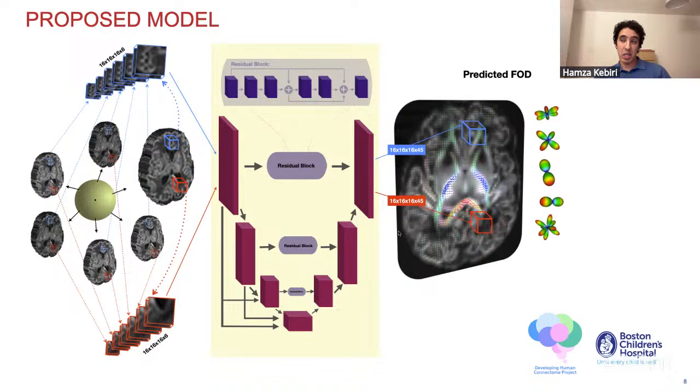They have a lot of neuroanatomical background, so they know how the configuration of the brain, the cortex and the white matter should be at that time. So they can use this knowledge to assess our deep learning estimations. And typically when we don't have a ground truth, for example for the fetal brain, because we cannot acquire long acquisitions and so don't have many directions, they are very helpful there.